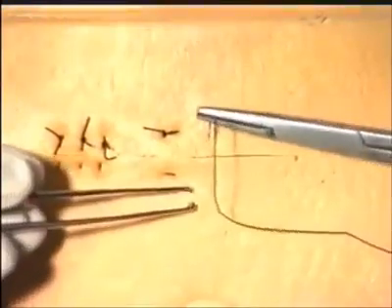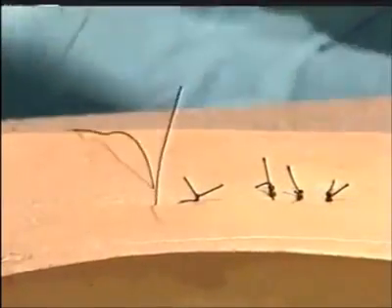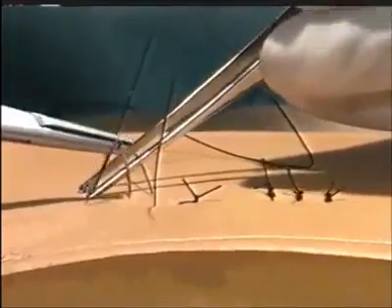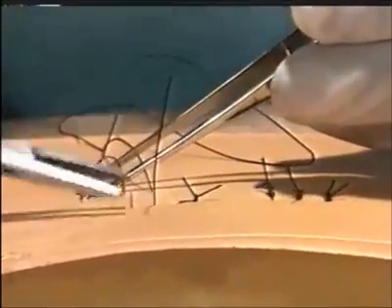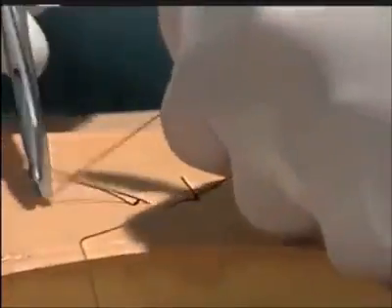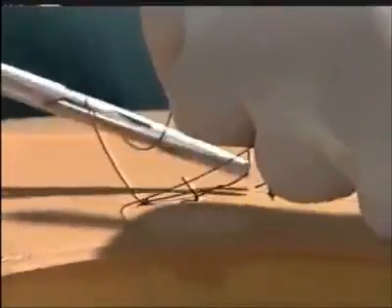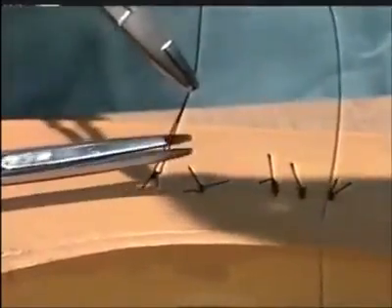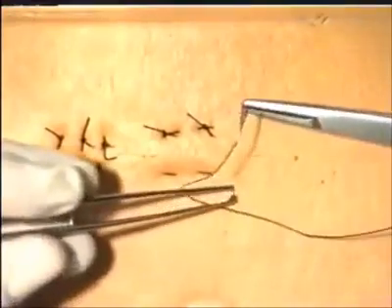We will now insert another horizontal mattress suture. The suture is inserted in the standard manner. The needle reversed, and then returned to the opposite side of the wound, parallel to the initial traverse. The suture is then secured with a reef knot. Both vertical and horizontal mattress sutures can be useful for ensuring eversion or inversion of wound edges, and this is clearly demonstrated by diagrams in your handbook.